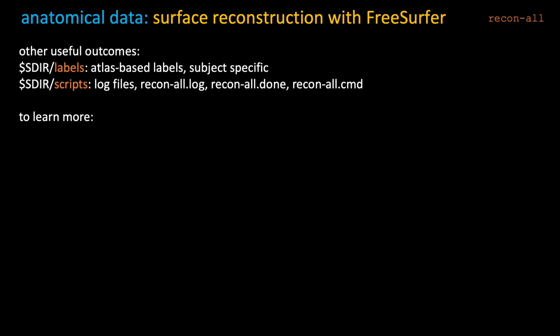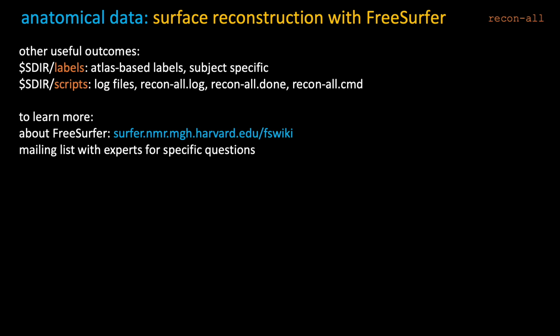Now, to learn more about FreeSurfer in general, there's an excellent wiki page with pretty much anything and everything you may ever want to know about FreeSurfer. There's also a mailing list with many experts, so if you have any more specific questions, there are over 100 commands in FreeSurfer, and they're under active development, so there's a lot of questions that will arise that might be just specific to what you're trying to do, and there will be someone, I'm sure, on this mailing list who will be able to answer these questions. So this is definitely a good place to look for help.